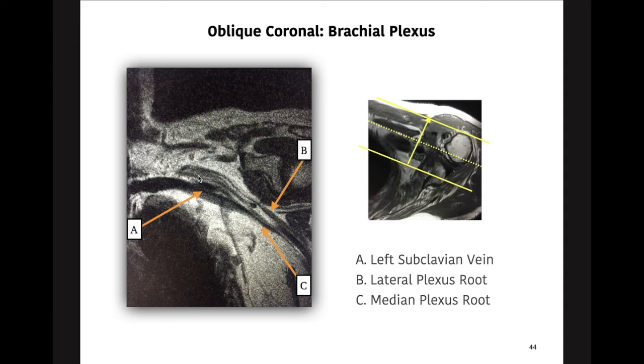We can see the lateral plexus root and the medial plexus root coming through, running right along here. From experience, someone with a bad shoulder injury may have fluid piling up and compressing the nerve, which also causes thoracic outlet syndrome. So compression doesn't necessarily have to be at the clavicle-first rib junction — it could be any other pathology, like a mass. There are all different types of pathologies that can happen at the brachial plexus. That's what it looks like on an oblique coronal view.